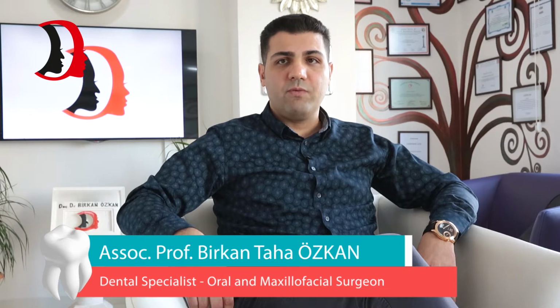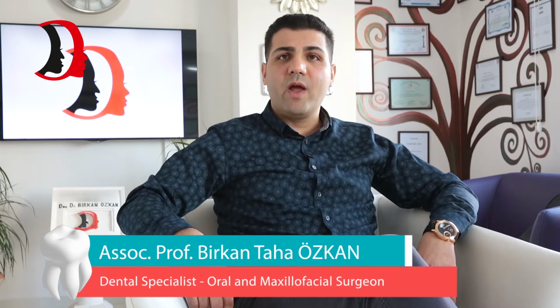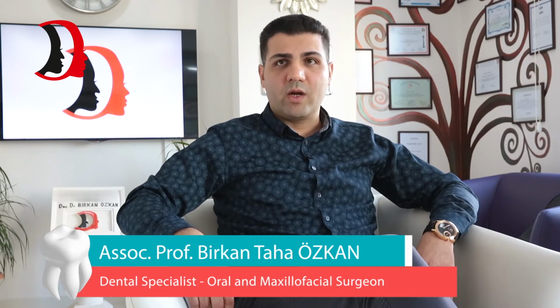I generally perform flapless implant surgery with laser without any cut of the medical drugs. For implant operations in patients with systemic diseases, such as those on anti-aggregant agents, I generally try to avoid cutting these kinds of drugs.